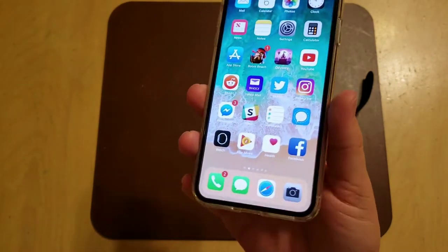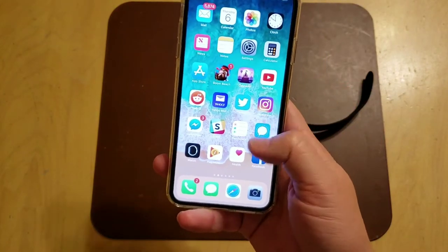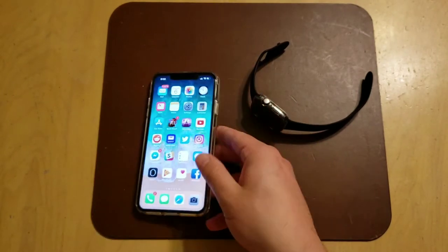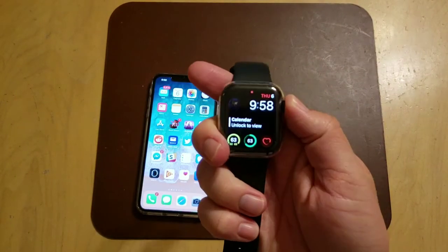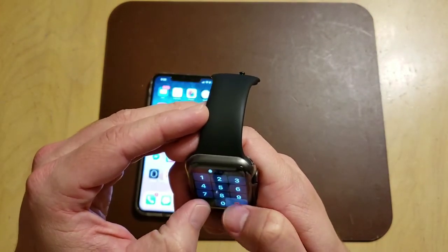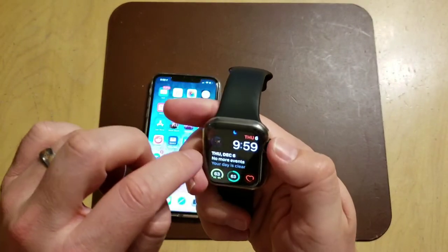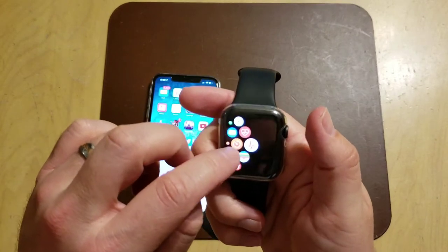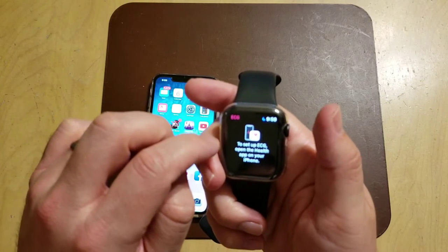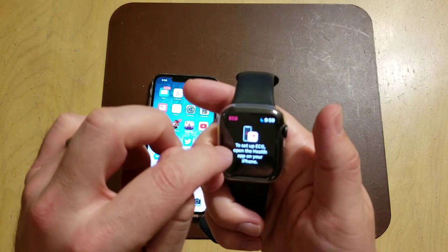If you want to make it work and you're on the beta, you're going to have to delete the beta profile, restart the phone, and then download the official update. Now let's set up the EKG/ECG feature. On your watch you can open the ECG app — it's the little squiggly line that looks like a heartbeat — and it'll say: to set up ECG, open the Health app on your iPhone.